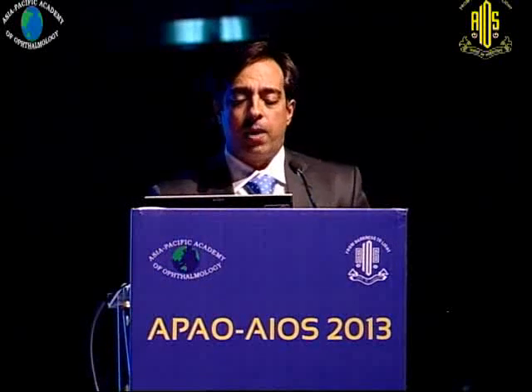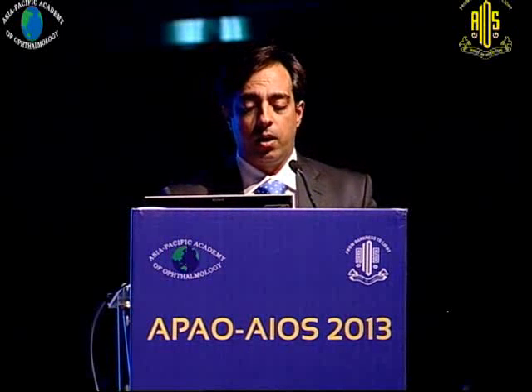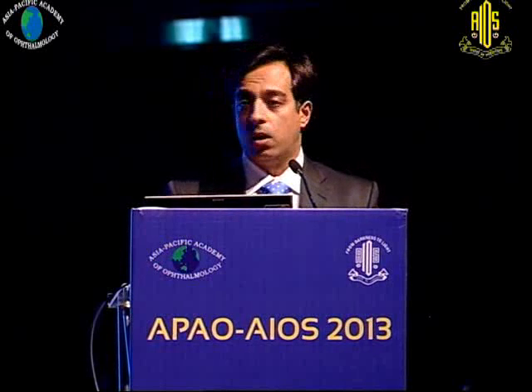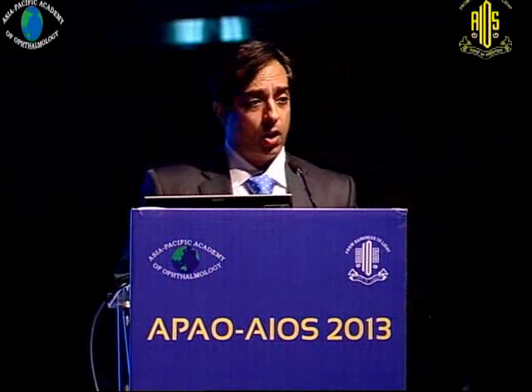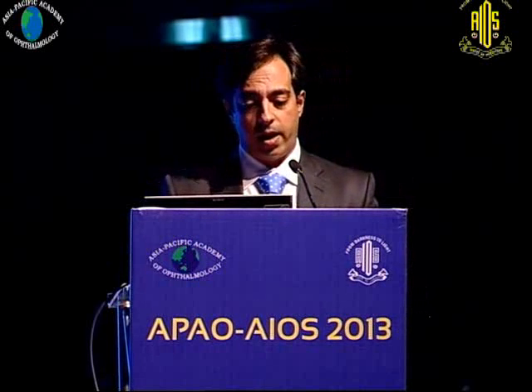The large subhyaloid hemorrhage over the foveal area for which we are operating again needs a similar approach. You first remove the core which is there, and then try and find a plane to remove the hyaloid adhesion, because the blood is usually trapped beneath that.